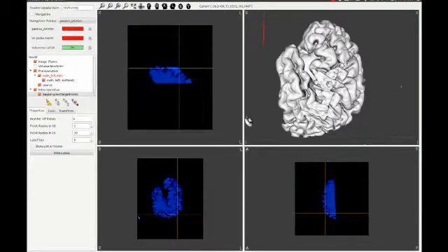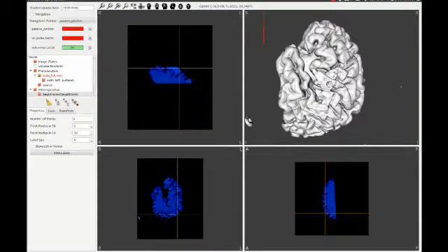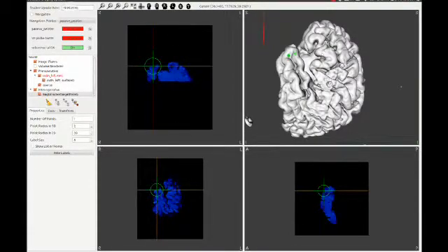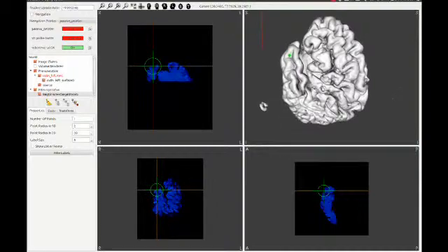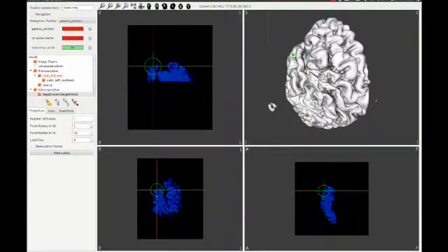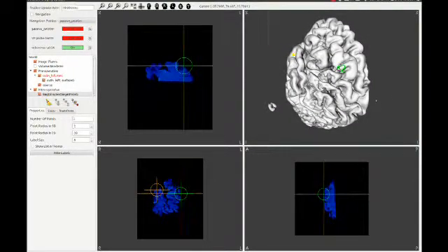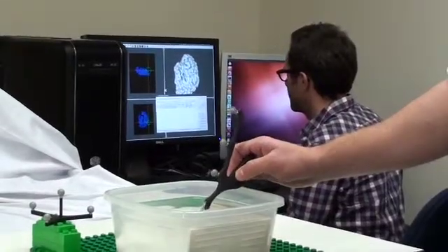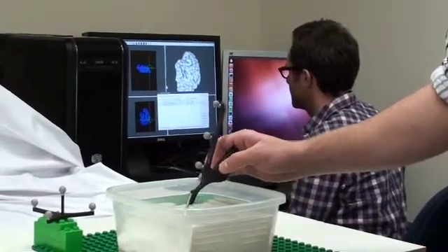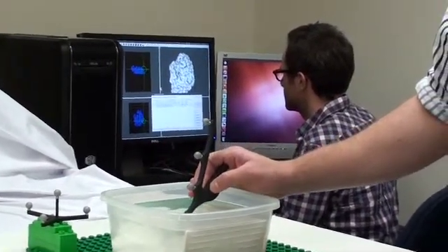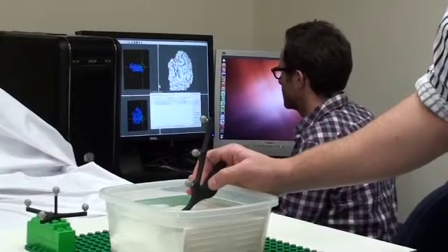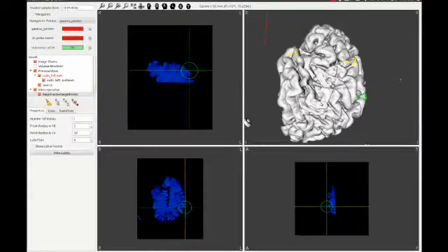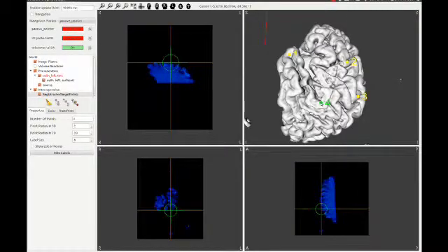The first step in the image-guided intervention is to register the patient's position with the preoperative image data. This is done by selecting the same points on both the preoperative images as well as on the patient. In a real surgical case, nine easily identifiable anatomical landmarks are used to perform the registration.